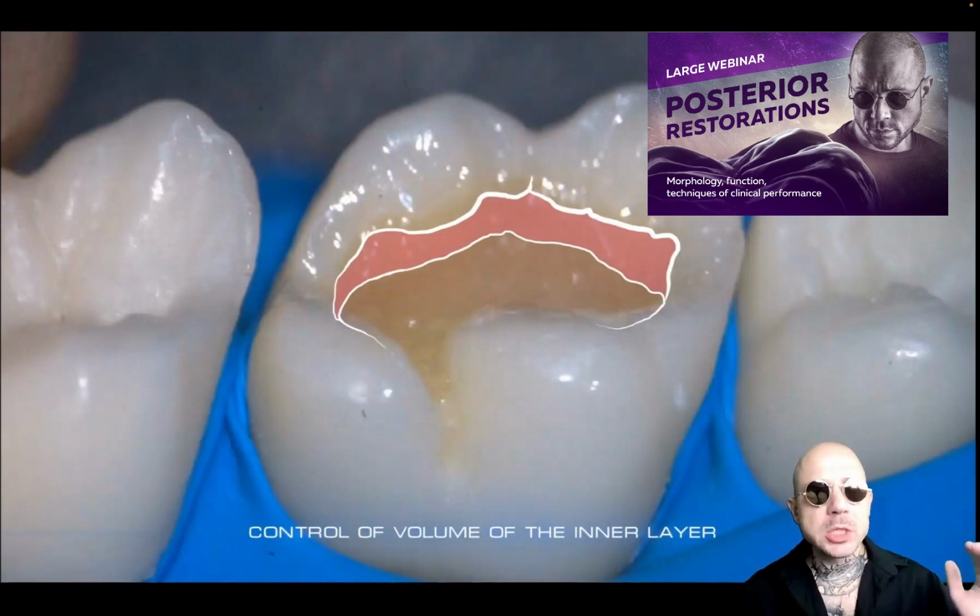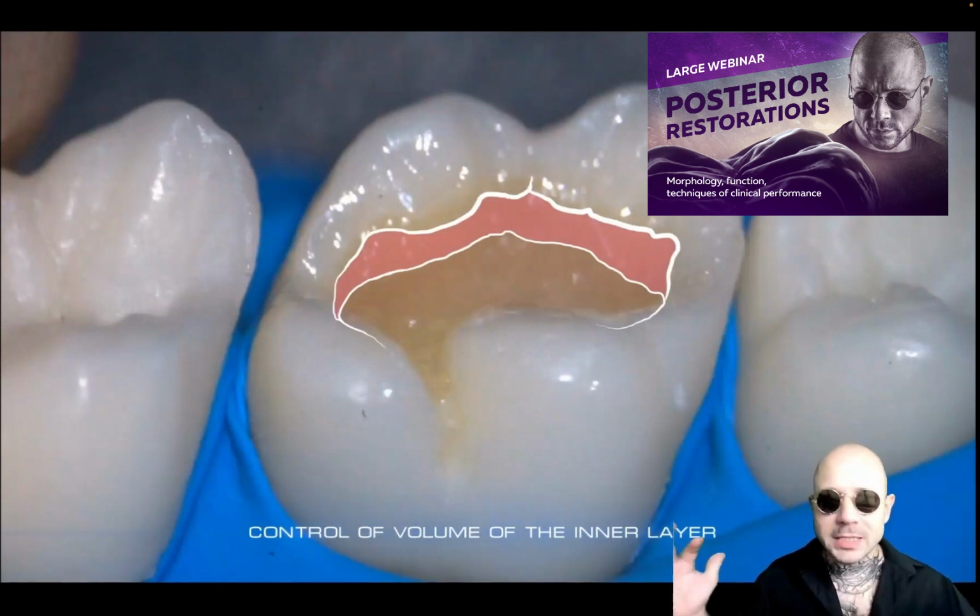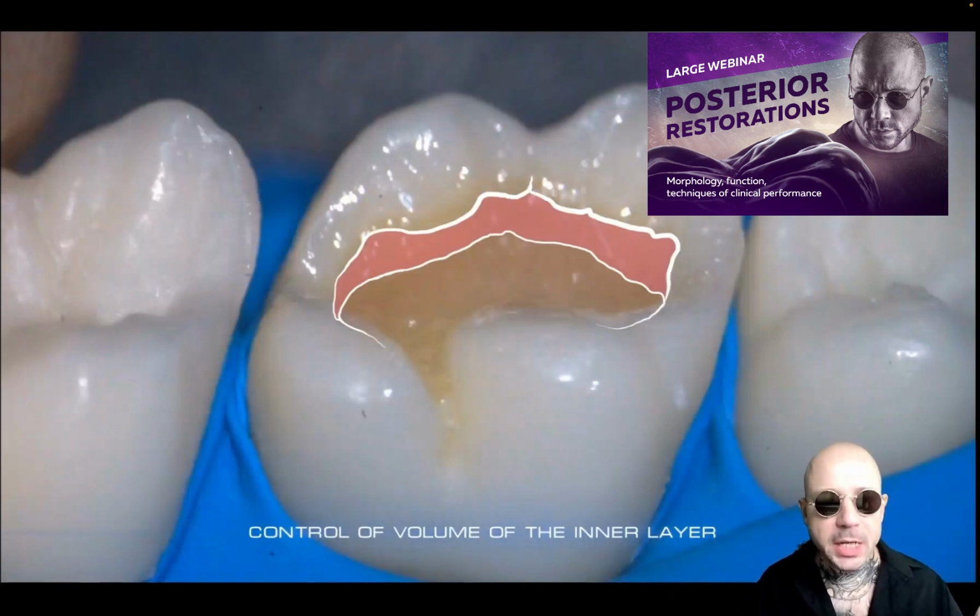It will be swallowed by the excessive free space inside.